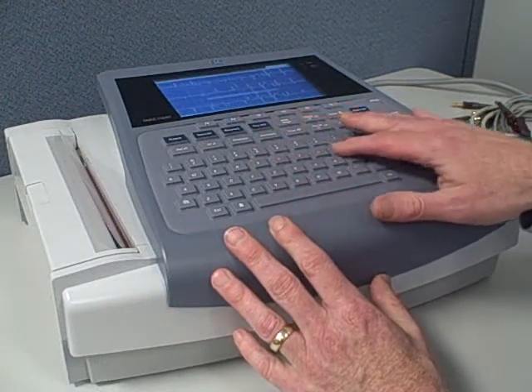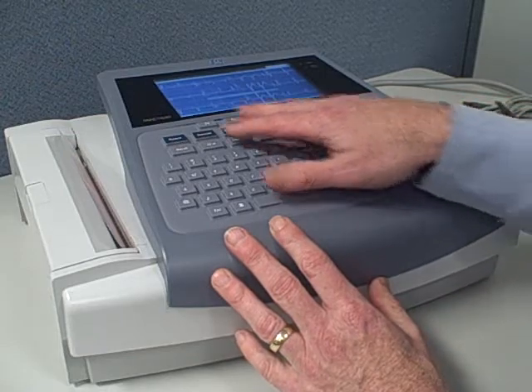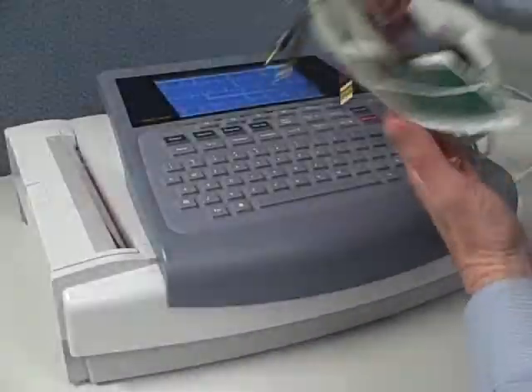A substantial machine, not a portable. A nice sealed keyboard is fluid proof, easy to read buttons, strong GE cabling system.